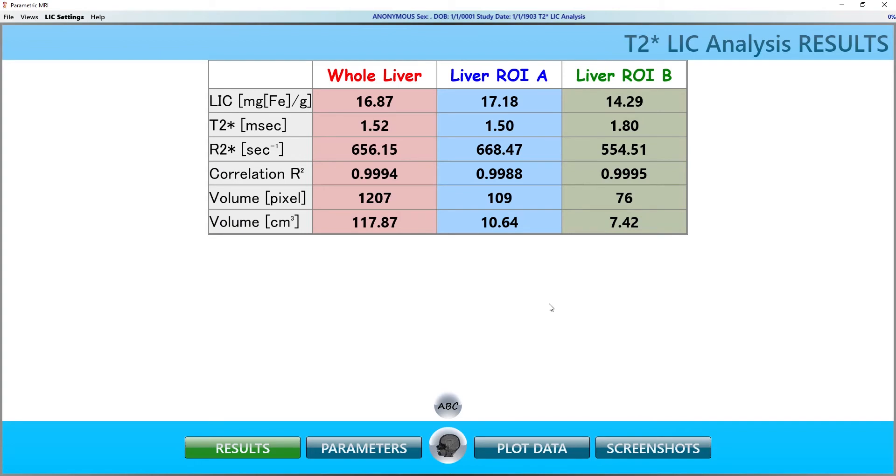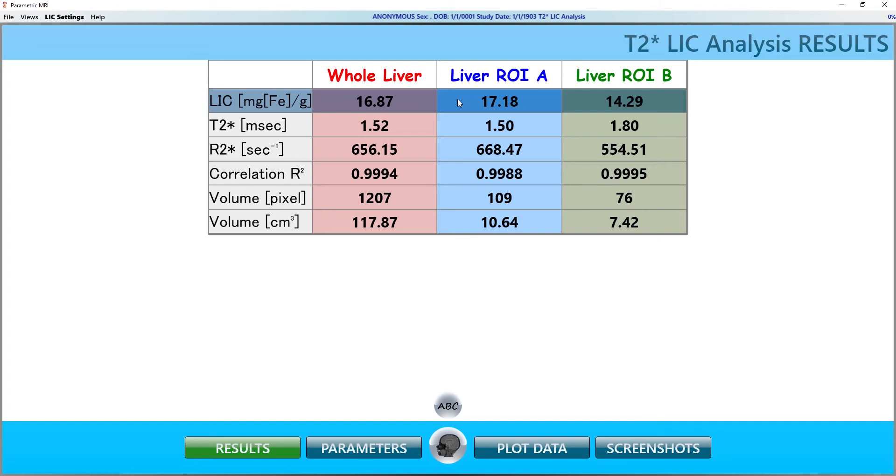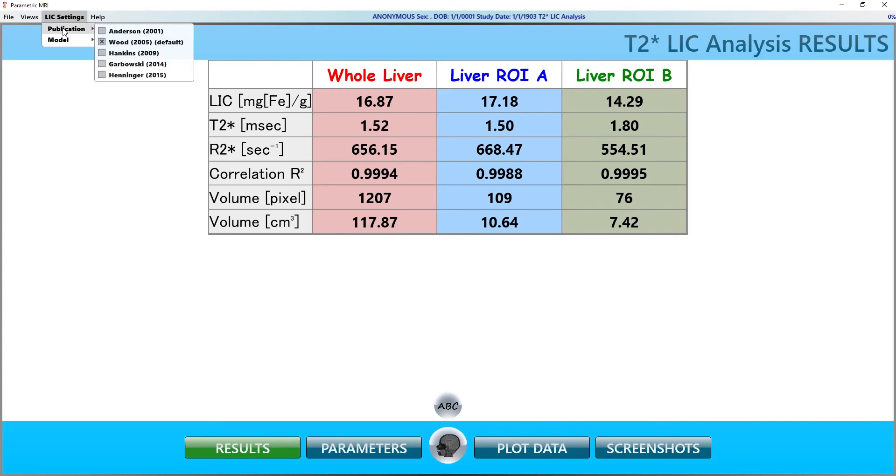The top row is the mean LIC value in units of milligrams of iron per gram of dry liver tissue. It is obtained by converting the mean R2 star value into LIC units as described in the paper I mentioned at the beginning of this video. You can select several different conversion methods from the LIC settings menu. Here, we'll keep it at the default WOOD 2005 setting.